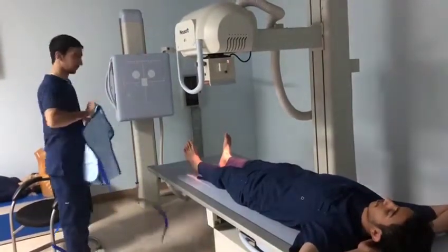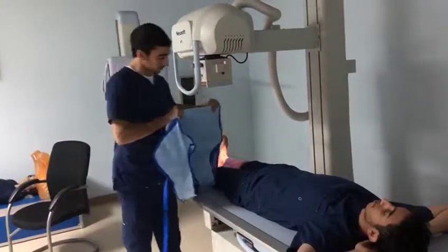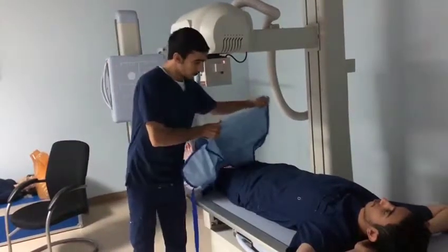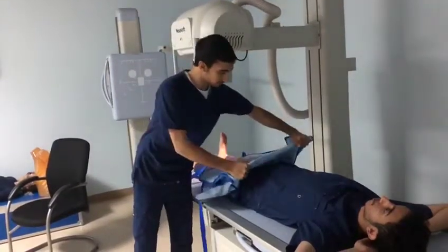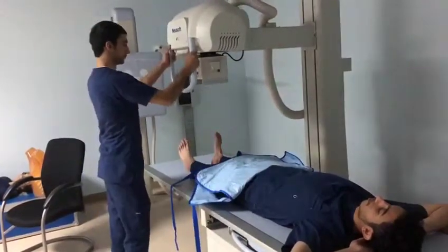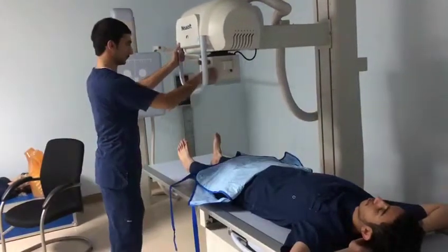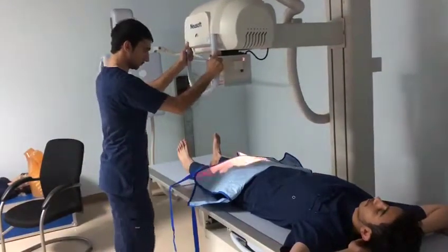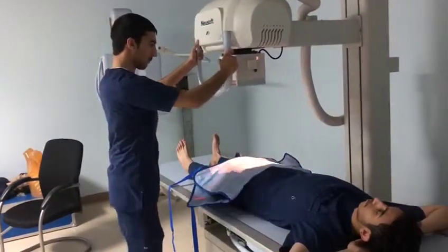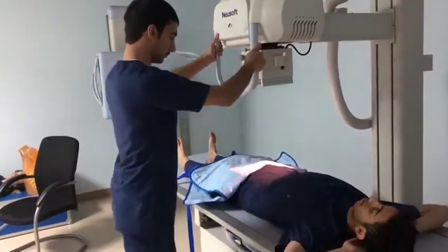After positioning the patient in an anterior-posterior position, the technologist applies gonad shielding, then starts to modify the collimation, and tells the patient to stop breathing.